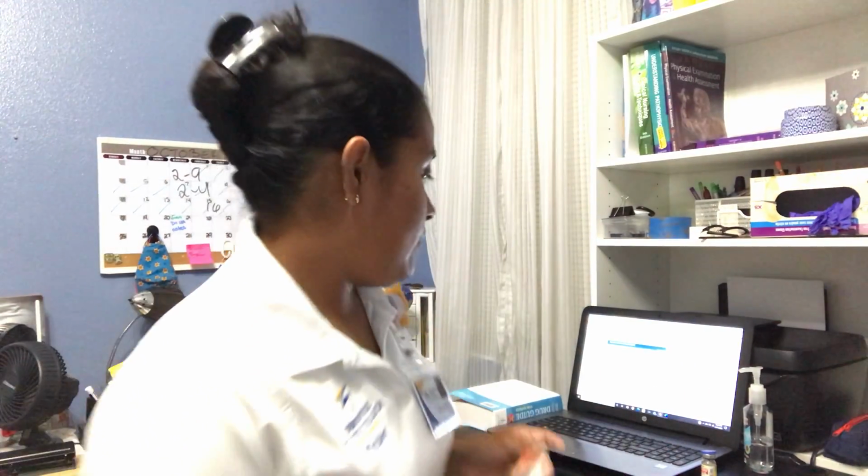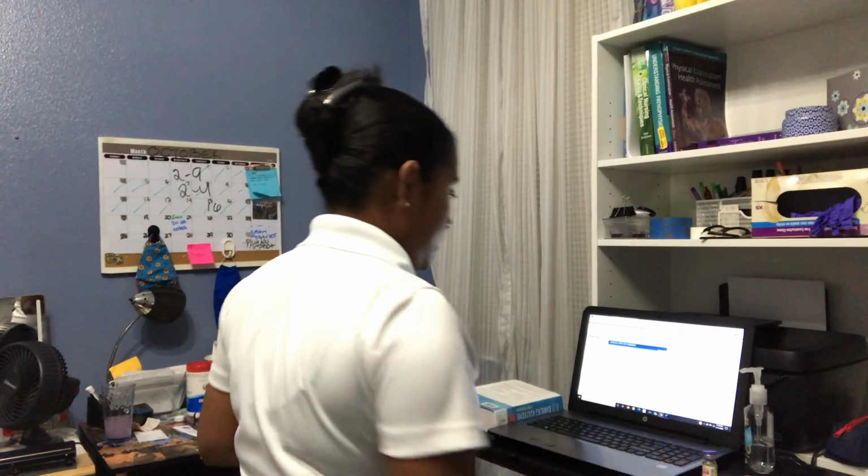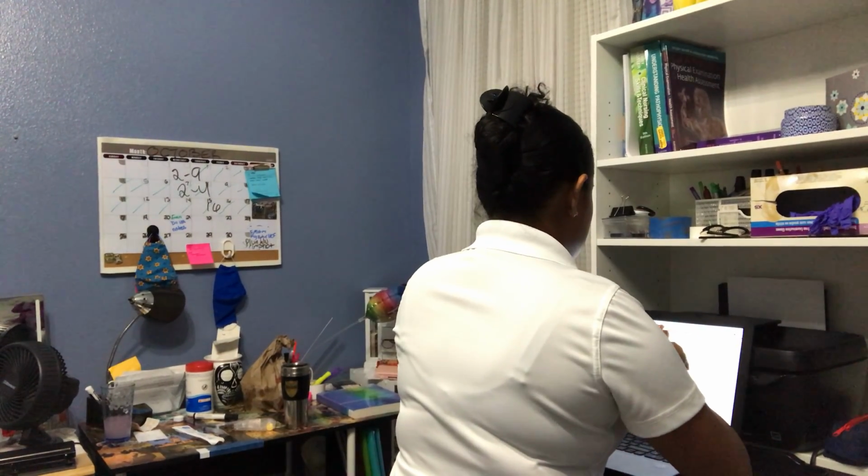And here is the needle necessary. Since it's insulin, it has a special needle because it is measured in units. There we go. I'm going to clean my hands again.